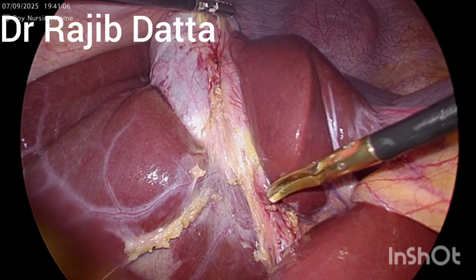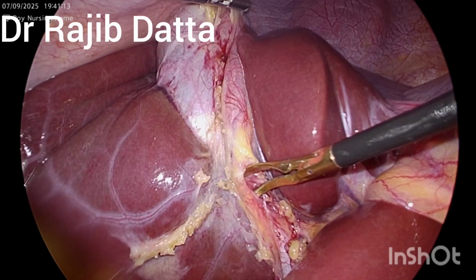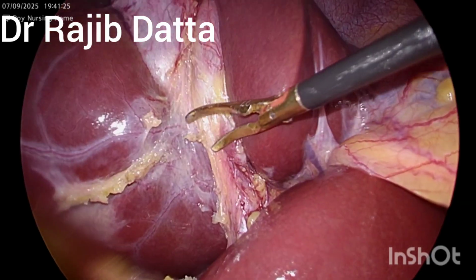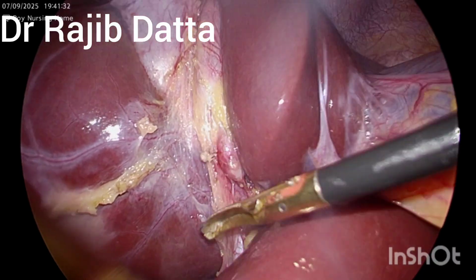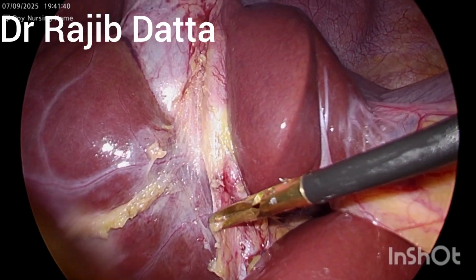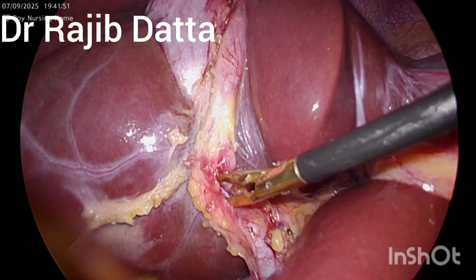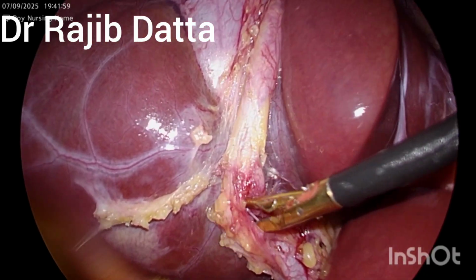And with this large jaw, I am trying to separate the cystic artery and the cystic duct, and small fimbriae can be tackled with it. So small fibrofatty tissue that is around this cystic duct has been taken care of.